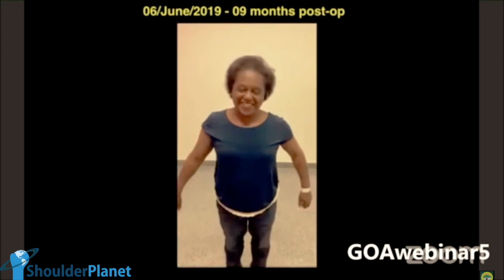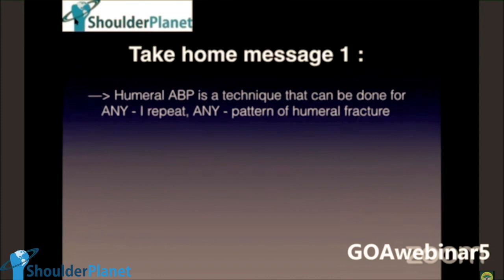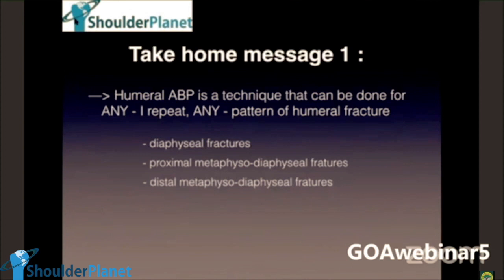If the patient is happy, I'm happy. So I have four take home messages and then I'm going to finish. I can do ABP in any, and I repeat, any pattern of humeral fractures. I'm talking about diaphyseal fractures in any pattern, proximal metaphyseal diaphyseal fractures and distal metaphyseal diaphyseal fractures. I'm not talking about proximal humerus fractures or supracondylar fractures. But as long as I can put two screws up and two down, for me, that's enough. For my team, that's absolutely enough.